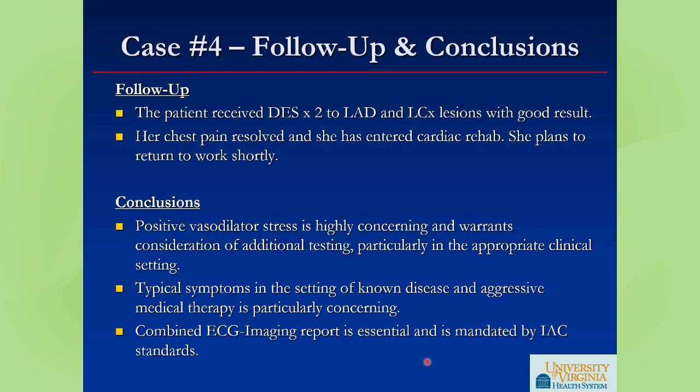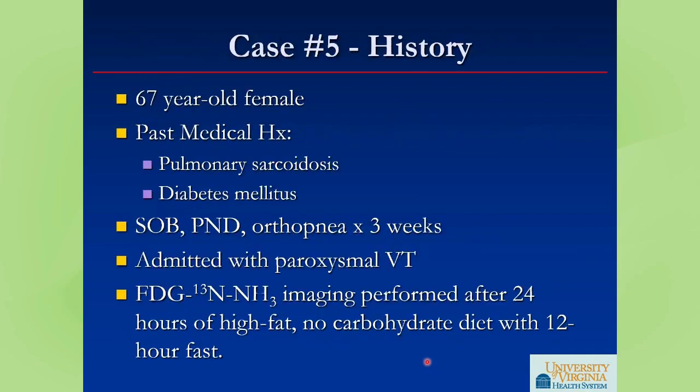So in conclusion, positive vasodilator stress is highly concerning and warrants consideration of additional testing, especially in the appropriate clinical settings, such as typical angina. So typical symptoms, especially if they have known disease, is particularly concerning, especially when they've been on aggressive medical therapy. And it's really essential to provide the combined electrocardiography imaging report. And this is currently mandated by our high IAC standards.